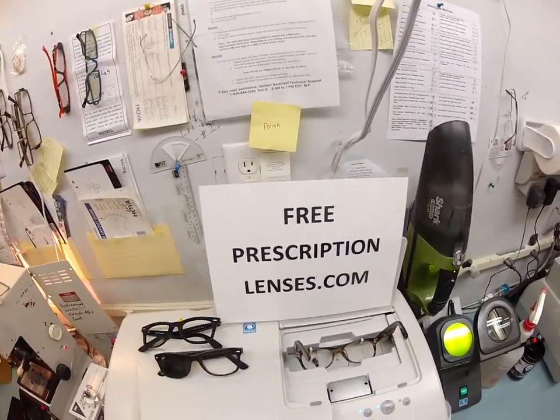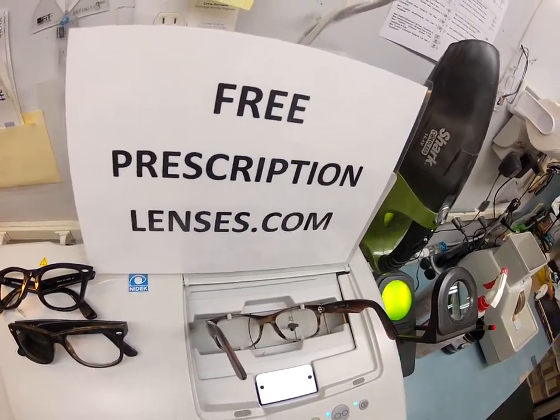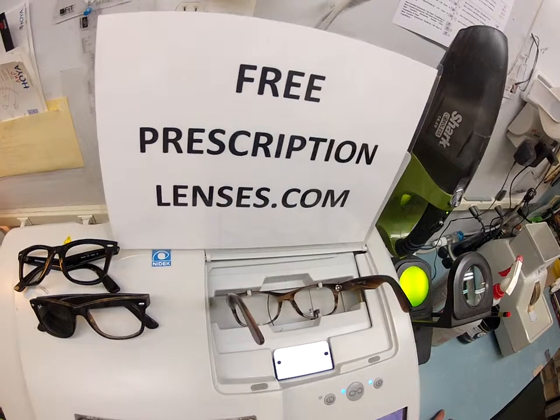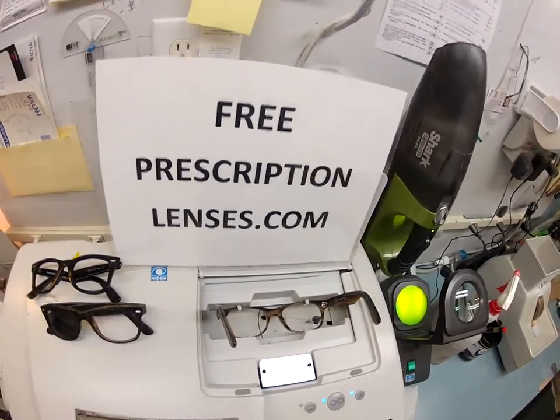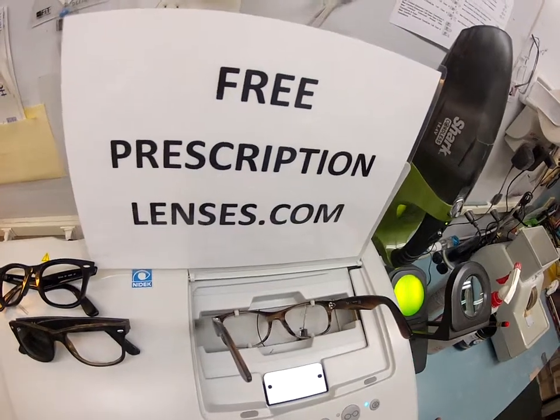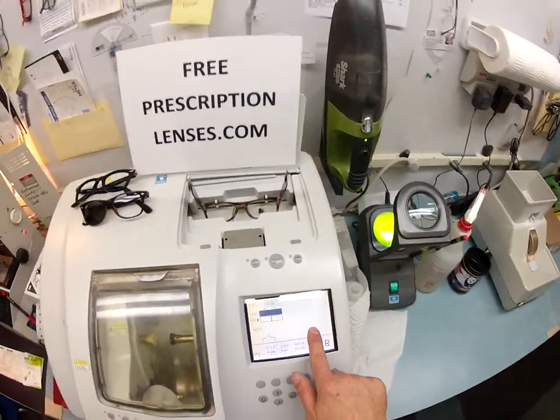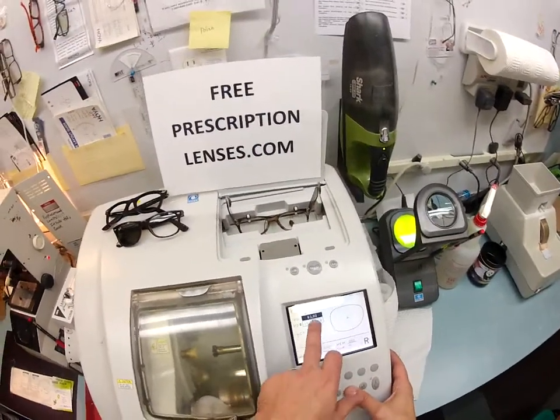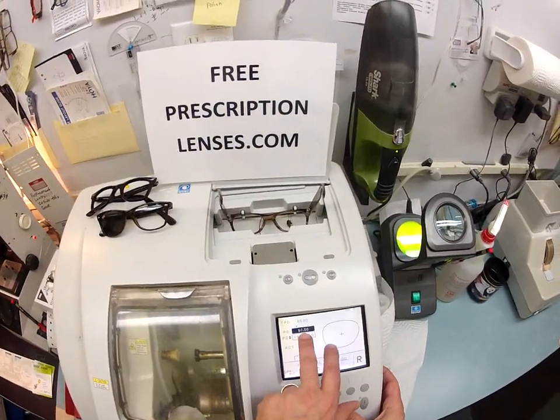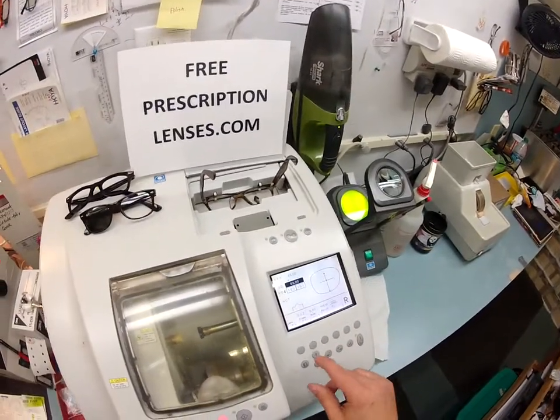Here at FreePrescriptionLenses.com you receive free clear lenses or free clear prescription lenses — prescription or non-prescription — with the purchase of a frame, because everyone likes a bargain and no one is disappointed with quality. So I'm going to pull the shape up onto the computer. If these were prescription I would be putting in your pupillary distance, but because these are not — they're known as plano — I'm going to match the frame's PD.